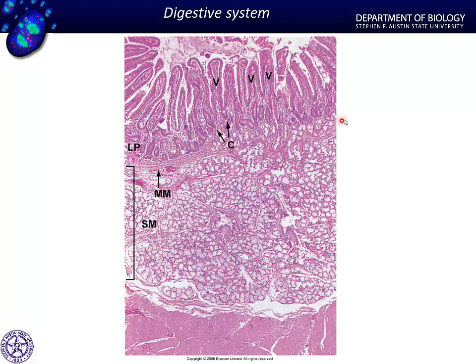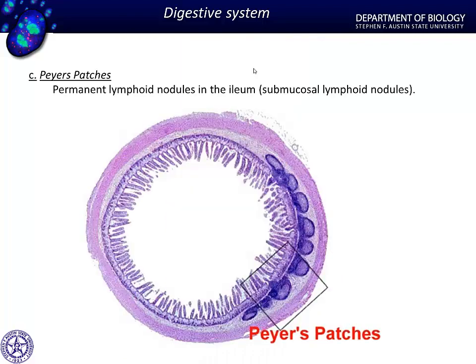Here we have our muscularis mucosa, and then all of a sudden you see this expanse of what looks like completely mucus acini in these tubuloalveolar glands. And so these are Brunner's glands, and when you see this in the submucosa with intestinal epithelium, you know you are in the duodenum. Now, as I've mentioned, we're simply going to have our submucosal connective tissue in jejunum. So if you don't see mucus glands in the submucosa, and you don't see Peyer's patches in the submucosa, then you know you're looking at jejunum.